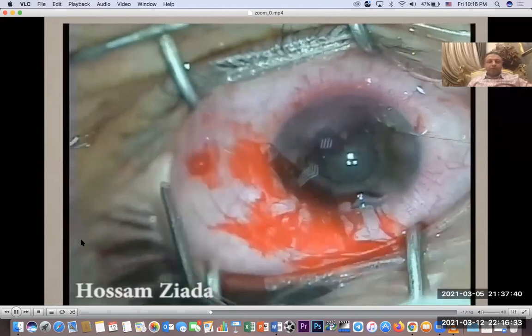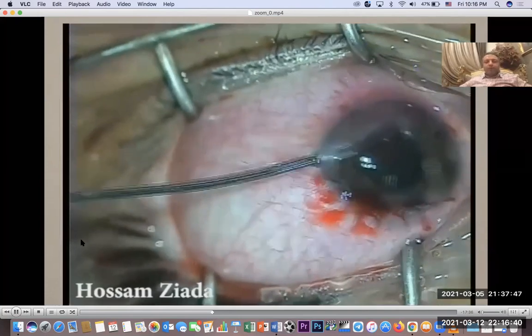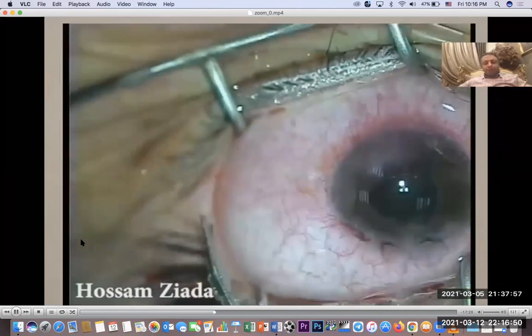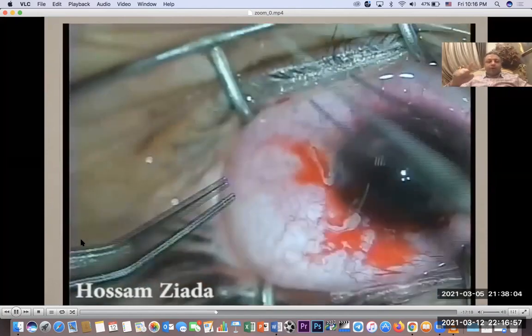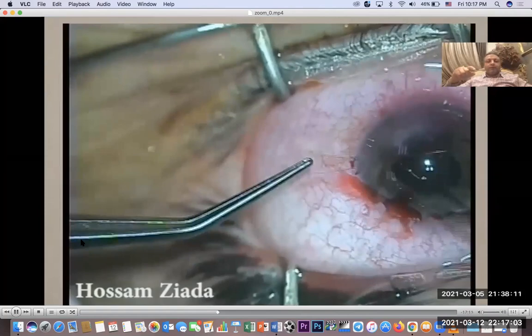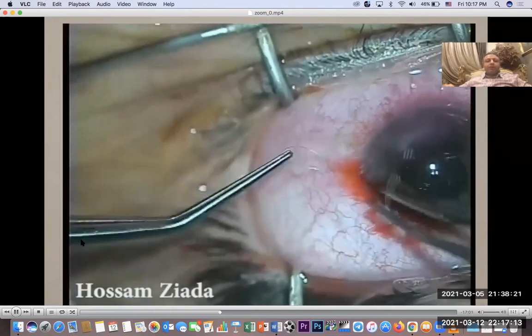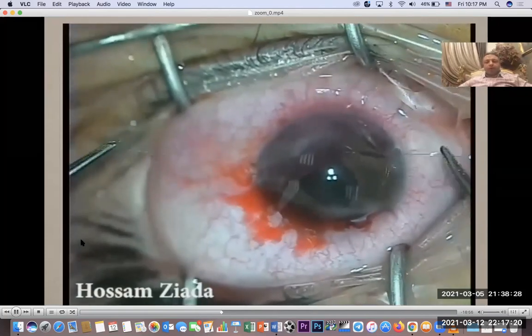Then I will keep both sides of the thread as such on both sides, then I will grasp the suture from the side of entry to take just part of it to make a circle, which is the one pass. Then on the left side or the exit side, you will cut it and then enter with this free end and count 4 times. Three times, yeah. I'm trying to go to the 4th, and be sure you can add 1 to be the 5th. It's very important to make them 4 throws.